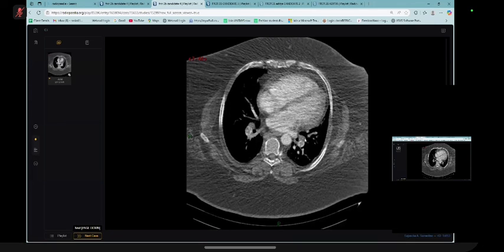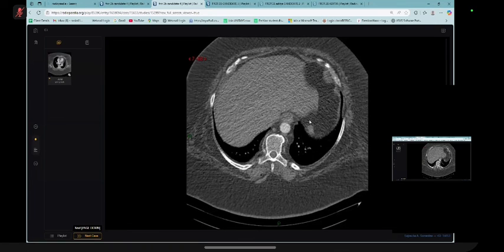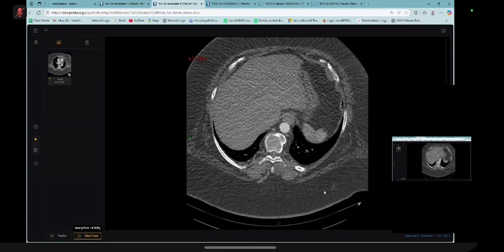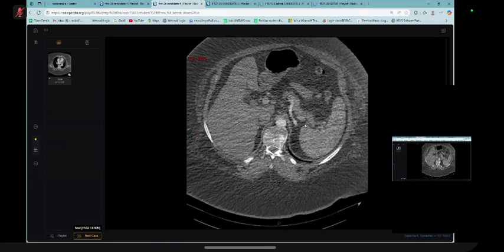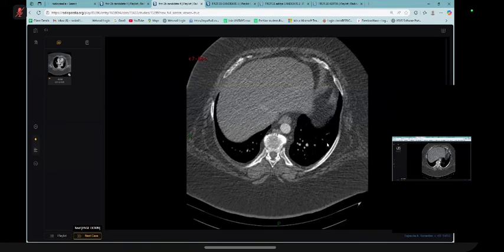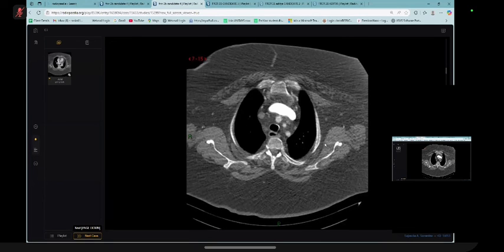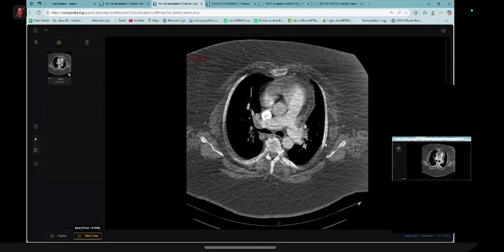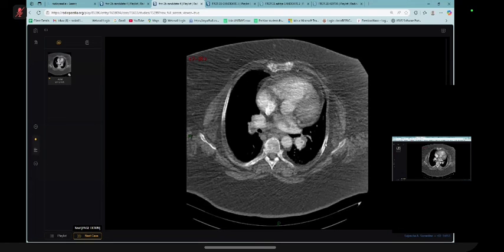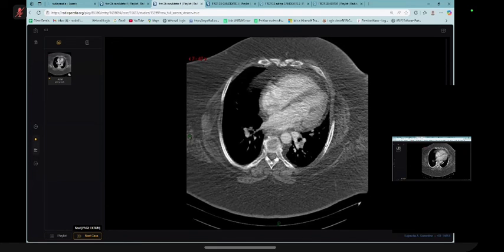Yes, please go ahead. Sir, ask for an ultrasound to see any associated DVT. Yes, ultrasound is also there. Whenever you are saying pulmonary embolism, always speak about the right heart condition, whether it is a strain pattern or not. Is the right heart enlarged, and is the pulmonary artery enlarged or not? Always say whether it is acute or chronic pulmonary embolism. Whenever there is calcification, it may be chronic. If there is no calcification, it is acute.